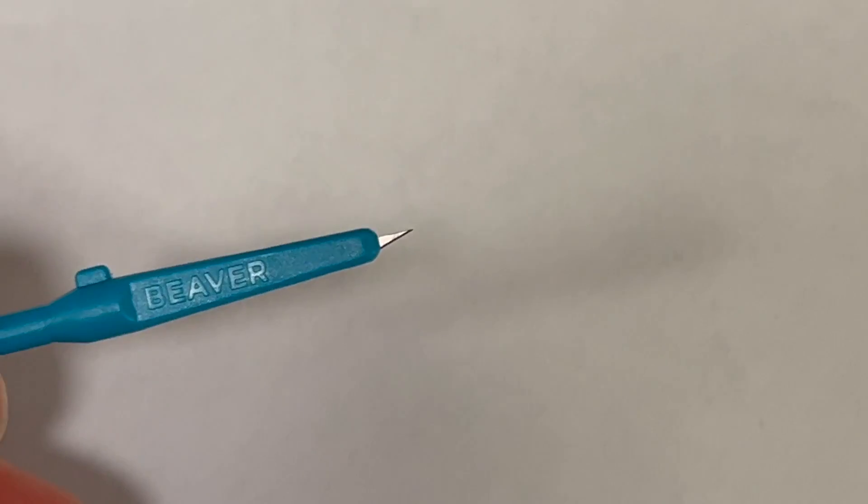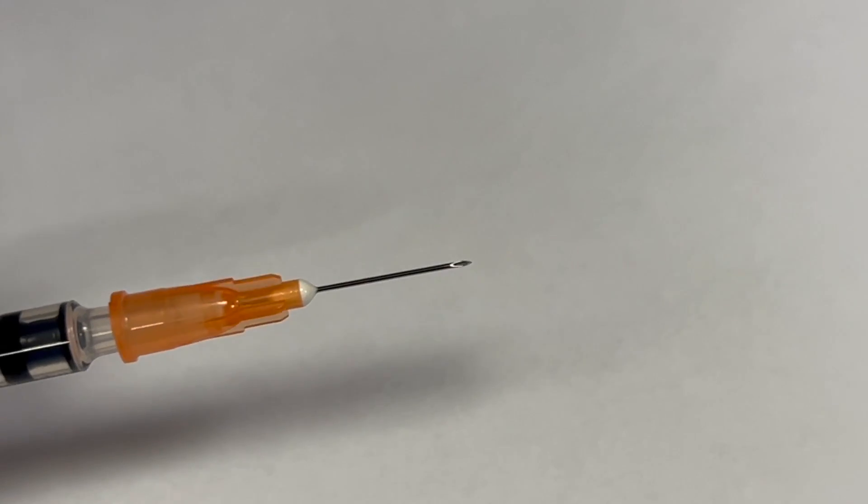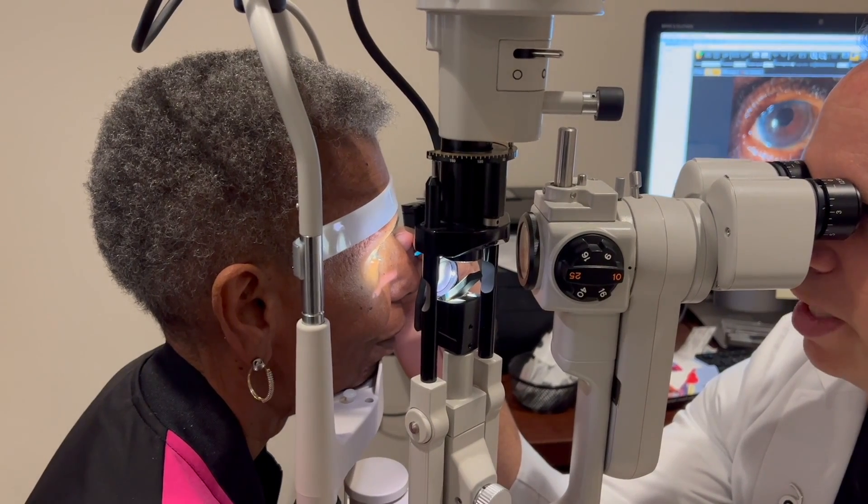The basic steps for taking out a corneal suture. Number one, the suture gets buried in the corneal epithelium, so you have to use the sharp blade or maybe the sharp edge of a 25 or 27 gauge needle to go under the epithelium and cut the stitch. Let's see what this looks like at the slit lamp.